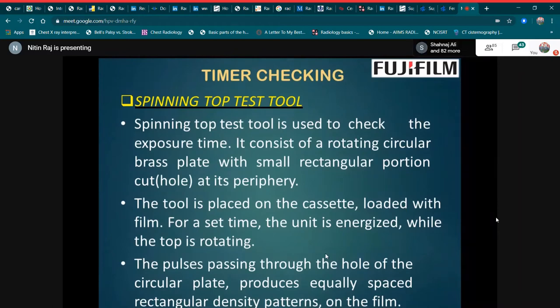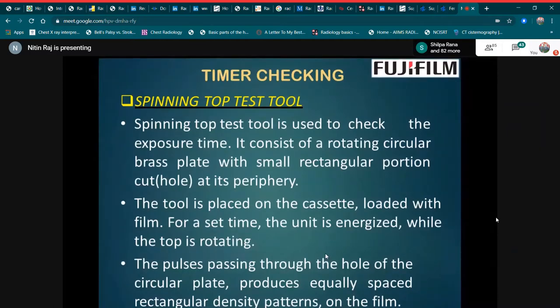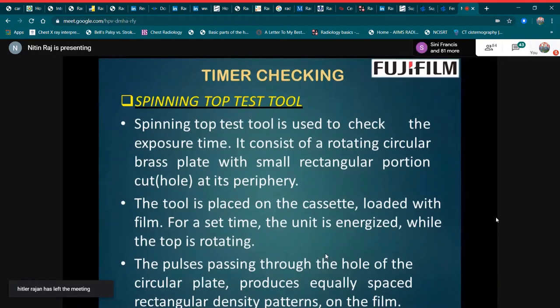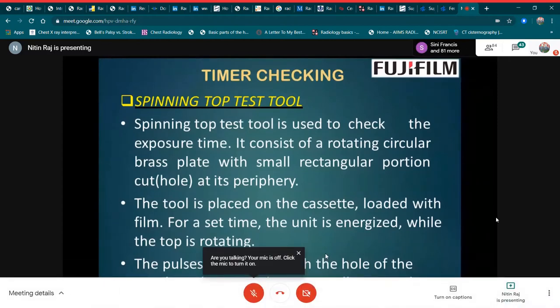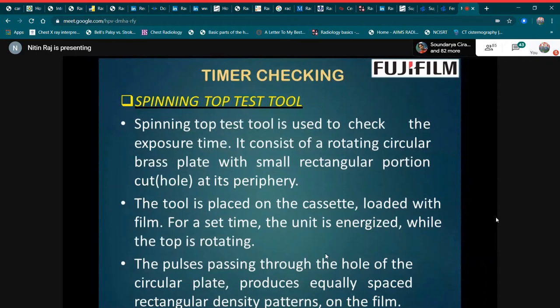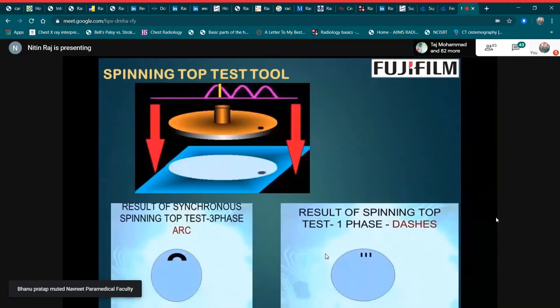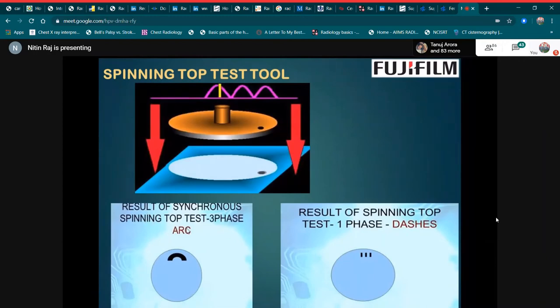Next is timer checking, performed using the spinning top test tool. The spinning top test tool is used to check the exposure time. It consists of a rotating circular brass plate with a small rectangular hole at its periphery. The tool is placed on a cassette loaded with film and the unit is energized while the top is rotating. The pulses passing through the hole produce equally spaced rectangular density patterns on the film. In three-phase systems it will show arc shapes, and in single-phase systems it will show dots or dashes.